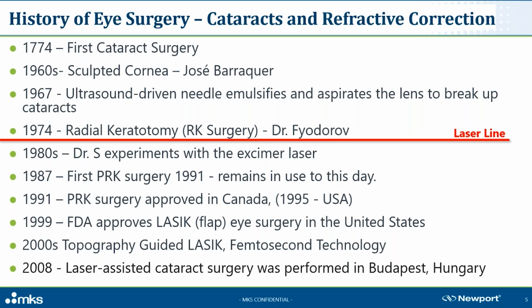Meanwhile, 2 European doctors discovered a method using an excimer laser to create a flap in the eye, rather than removing the outer epithelium layer. The surgeons fold the flap out of the way to gain access to the cornea, perform the laser reshaping, and unfold the flap back when complete. This helped reduce post-surgical discomfort and accelerate the healing process. This innovation signaled the dawn of the modern-day LASIK eye surgery and was approved by the FDA in 1999.